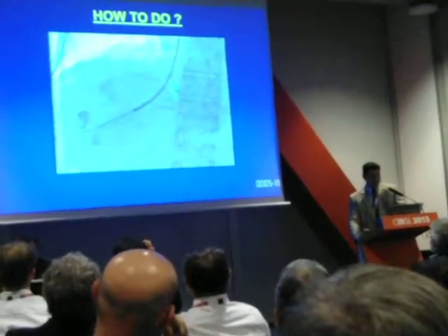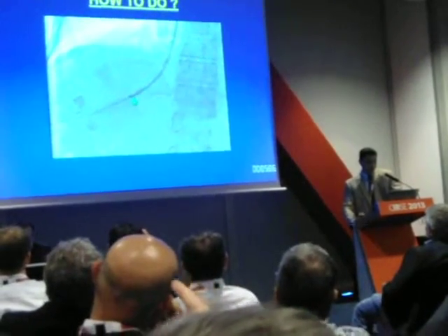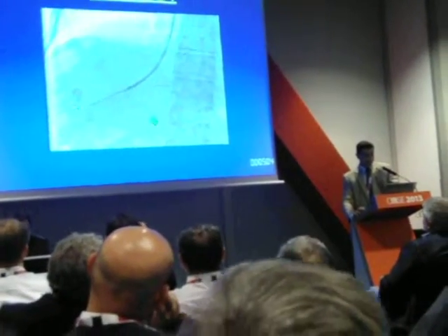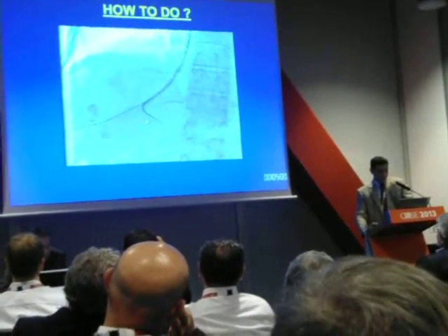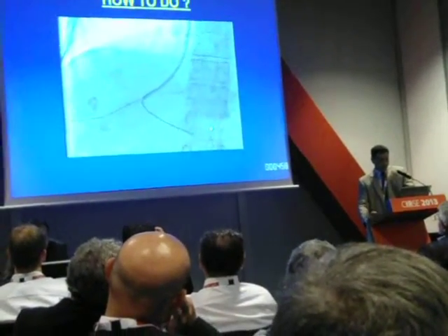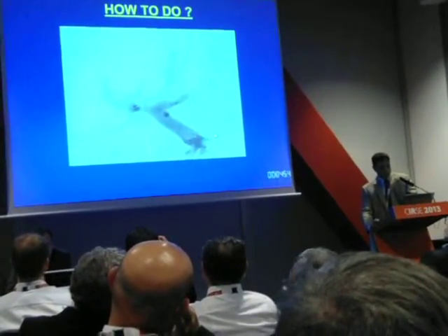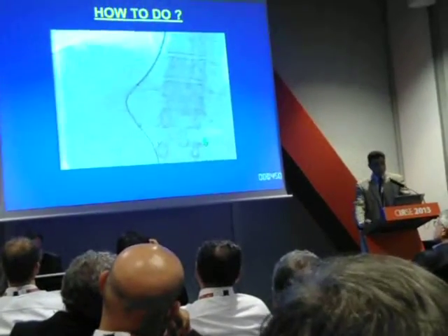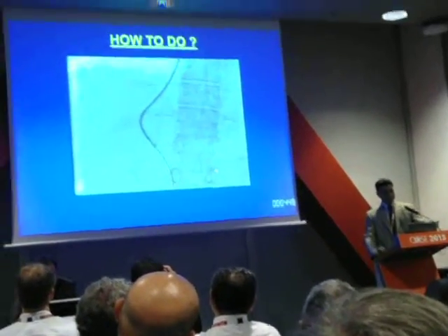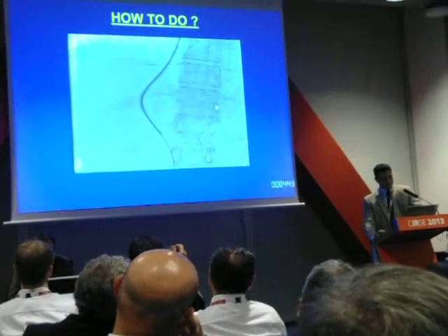We leave this guide wire in place and then introduce another guide wire into the sheath from the jugular side and manipulate it into the main portal vein. So this technique may also be called the double wire technique. Then we advance a manipulation catheter over the guide wire into the portal vein to do portography. Then we advance the sheath into the main portal vein, followed by the stent inside the sheath, and we draw the sheath up to deploy the stent from below upwards.